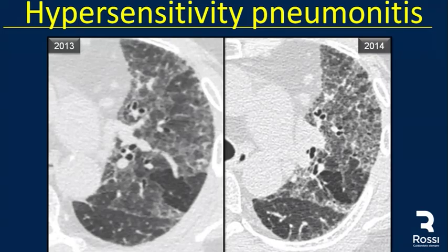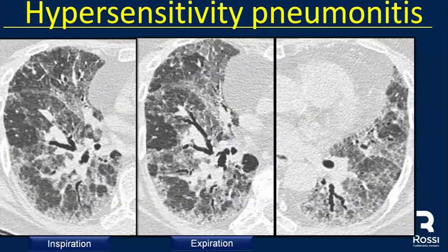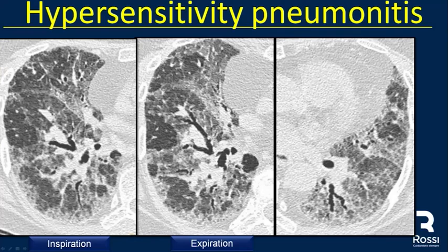Patients can also have fibrotic hypersensitivity pneumonitis, where we see mosaic attenuation with areas of high attenuation and triangular areas of low attenuation. On expiratory CT we see a triangular area of air trapping. Air trapping in chronic or fibrotic HP occurs in areas of normal lung, not in fibrotic lung. We also see traction bronchiectasis and some distortion of the lung in a patient with fibrotic HP.